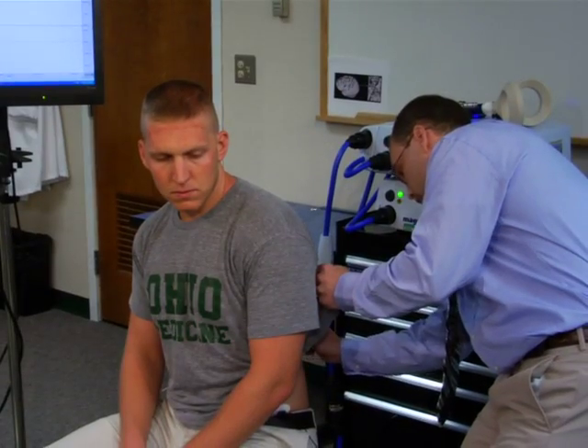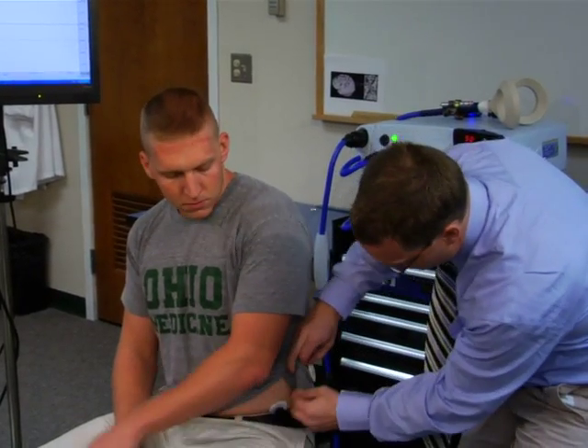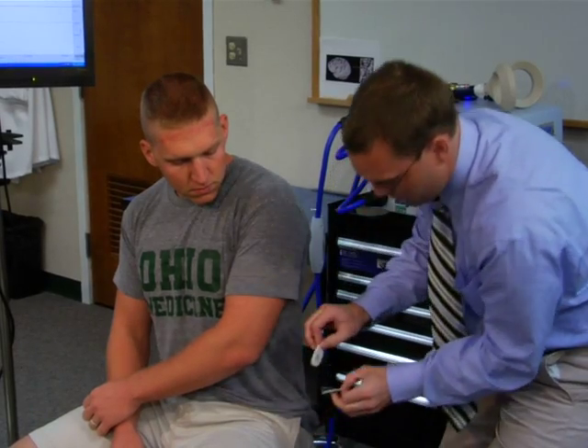When the experiment is complete, assist with the removal of the electrodes and Lycra cap, and be sure to thank your subject for participating.